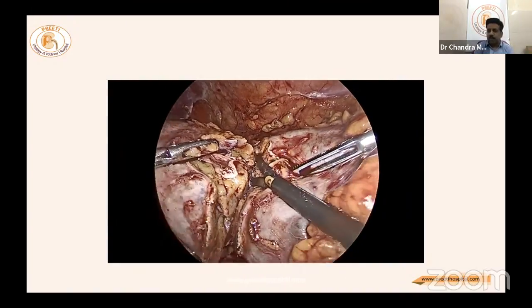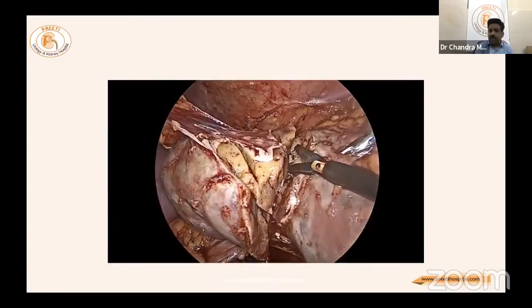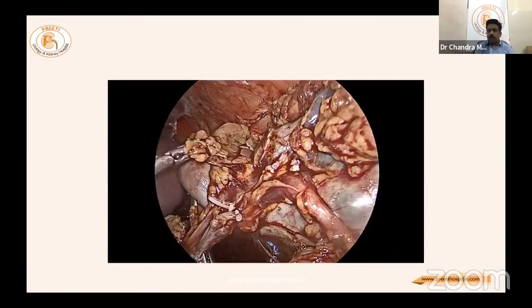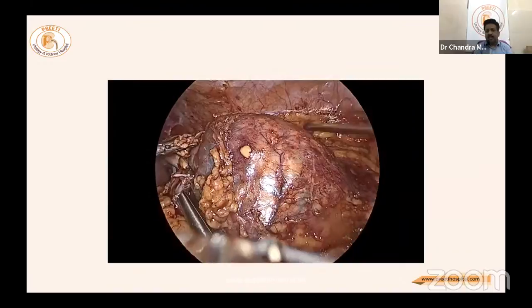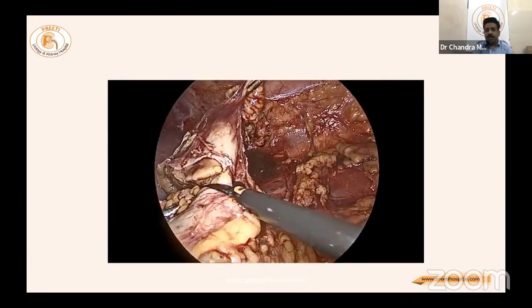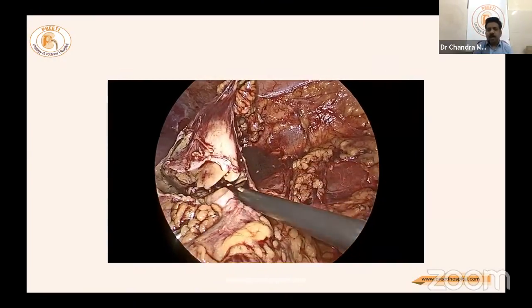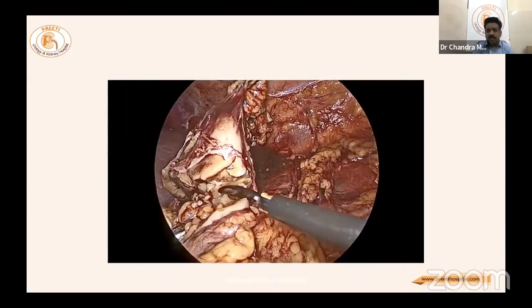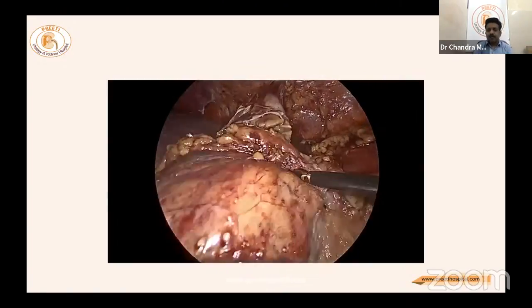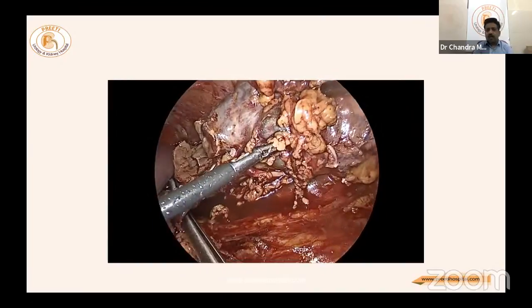This case demonstrates how hemi nephrectomy can be performed ergonomically laparoscopically. Now close to the hilum, the kidney is tilted — a key advantage of complete mobilization. Only a small part of the kidney remains attached and is divided last, close to the hilum, so that the upper polar vessels — the one lifted being the normal kidney — can be handled. The remaining vessels can be clipped or sutured.